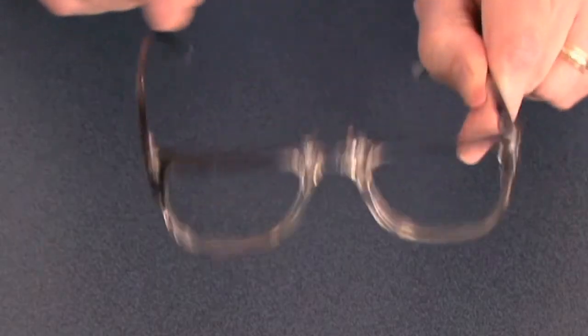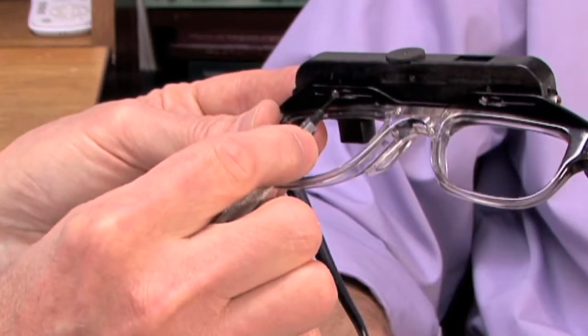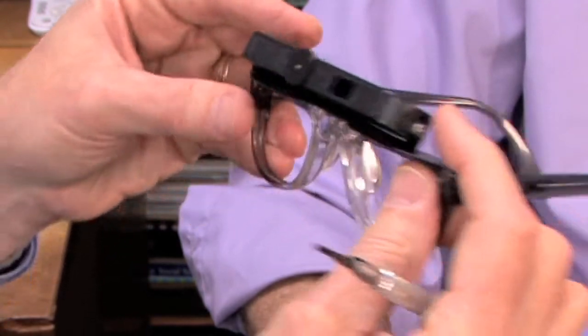Fitting the ArchiTech VES-2 is quite easy to do. The telescope is attached to the frame with a mounting bracket with two set screws on the bottom, which when loosened allow us to move the telescope right to left to line it up for the patient's pupillary distance.